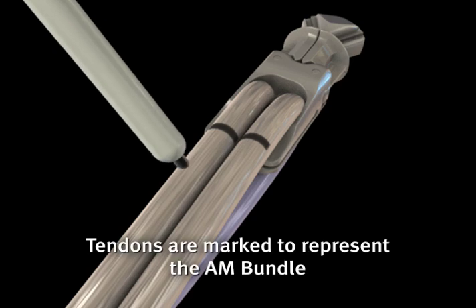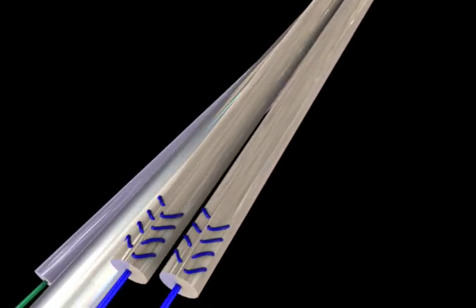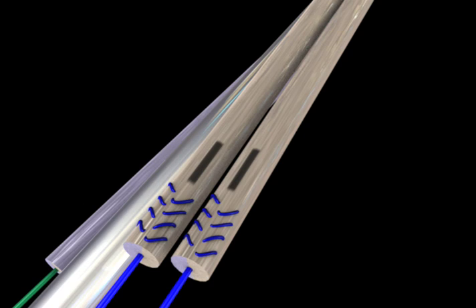Additional marks are placed on the two tendons that will represent the AM bundle, one mark near the implant and another mark close to the sutures, to help with the orientation of the AM and PL bundles once inserted into the femoral socket.